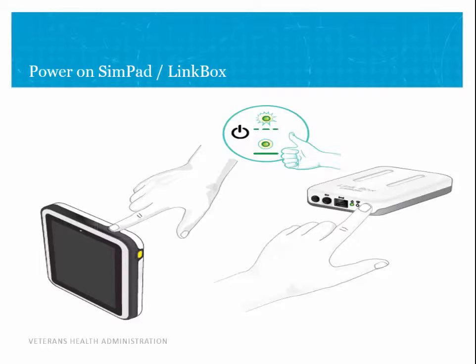To turn on the SimPad, press the power button located on the top for at least half a second. You're going to visualize the green LED that will be blinking while it's turning on. Then there'll be a Laerdal start chime followed by a 5 icon home screen.